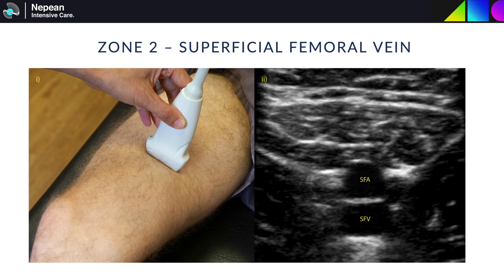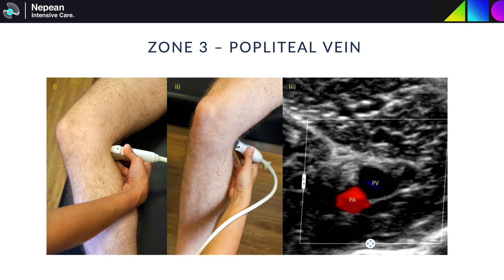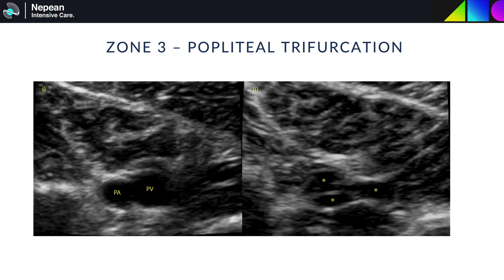Sliding the transducer down shows the bifurcation of the femoral vein. The superficial vein should then be followed into the adductor canal until it's no longer visible. In the adductor canal, the femur does not underlie the vessels, so the non-scanning hand may need to be held underneath the medial aspect of the thigh to allow compression. Lastly, the popliteal vein should be seen superficially to the popliteal artery in the popliteal fossa, followed upwards until no longer seen and downwards until the popliteal trifurcation.